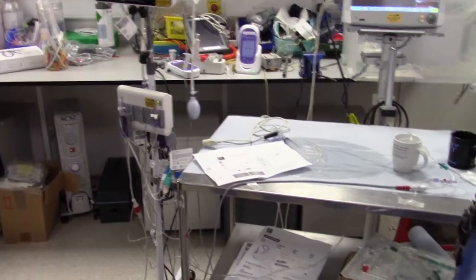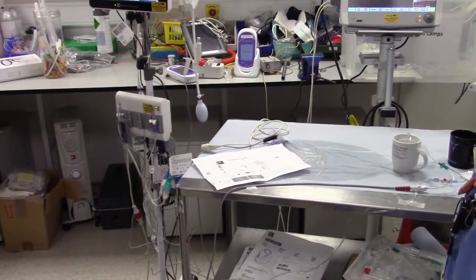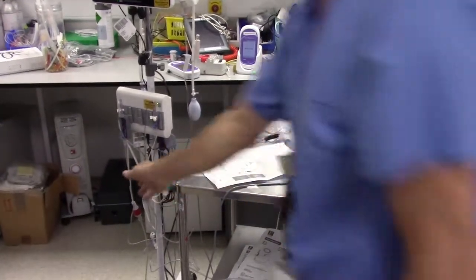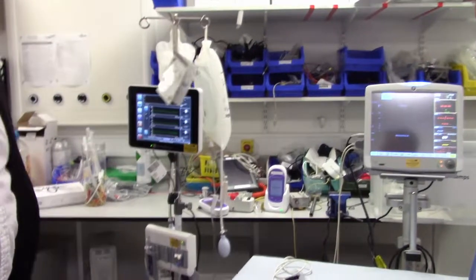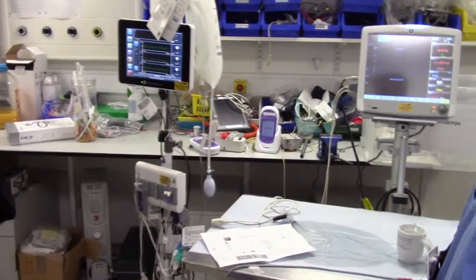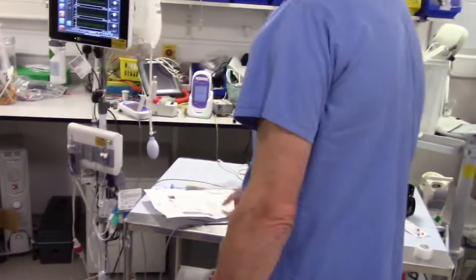So better labelling is going to help, and we can do that. We can make some laminated labels so that it's really clear that that's going to go to the arterial cable on the monitor. It doesn't even tell you here, it just gives you a red line. I agree with you, it's not very good, and it also doesn't show that three-way tap in the diagram.